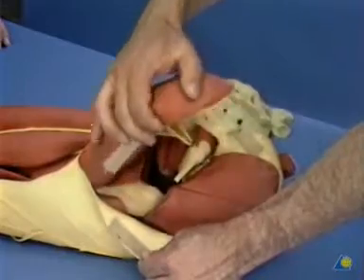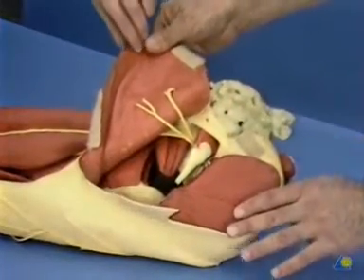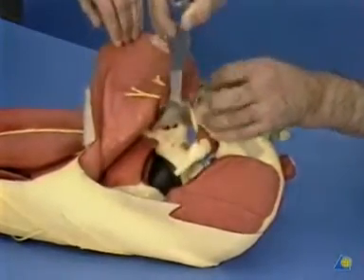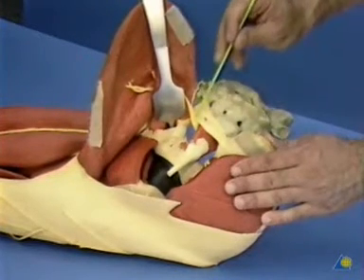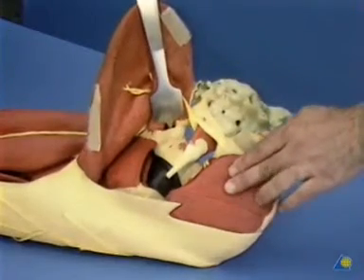On the model, we will reflect the gluteus maximus muscle posteriorly. Then place a retractor into the lesser sciatic notch beneath the obturator internus muscle. This retracts that muscle, plus it retracts the sciatic nerve. We have to be careful with tension on the sciatic nerve.